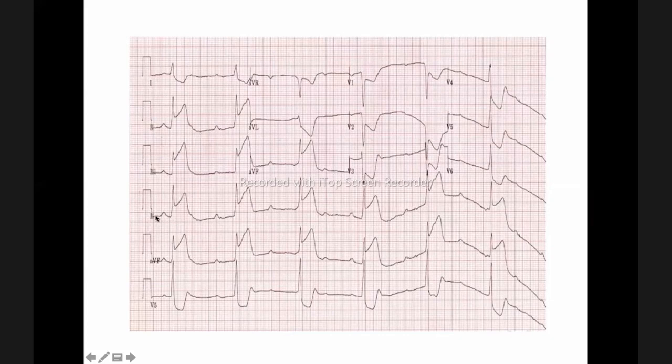But it doesn't just end there, because this is a long lead 2, okay? So let's go to lead 2. You can even use this one, but it's too short. But this one is probably better. So we're looking for a relationship. First, we're looking at the heart rate, and we counted the number of big boxes here, divided 300 over the number of big boxes, and over about 8 big boxes gives you a heart rate in the 30s, or at least 30 something. Imagine if your heart rate was 30 something, would you be okay? Very sick. Already that's your first clue that there's something more serious going on.